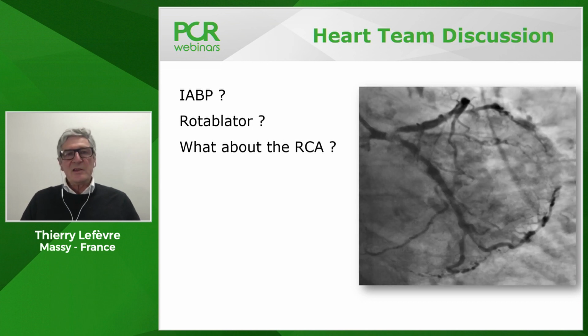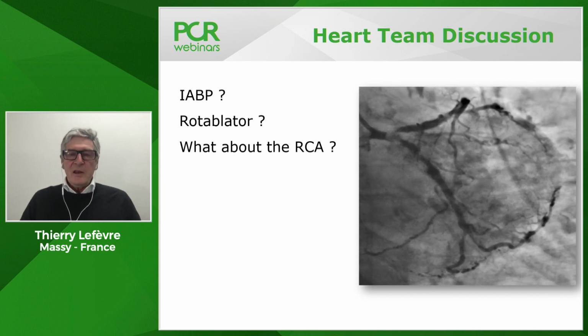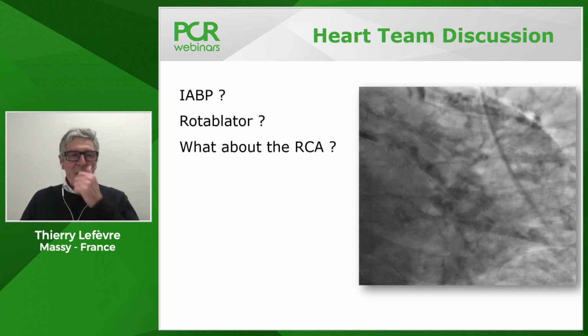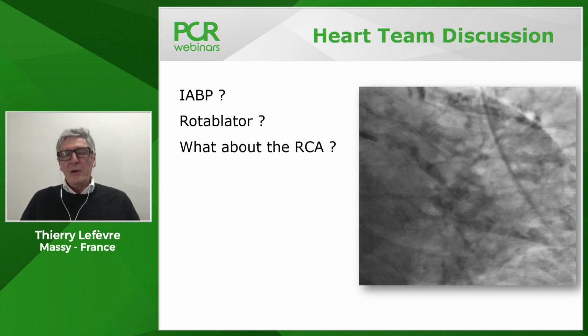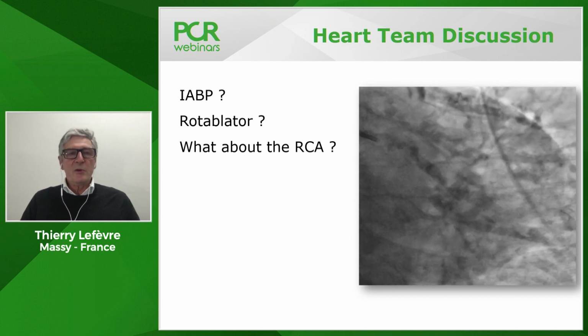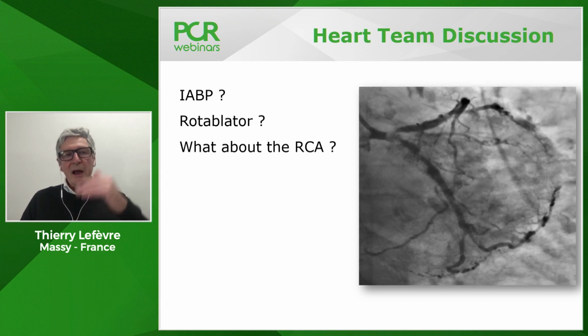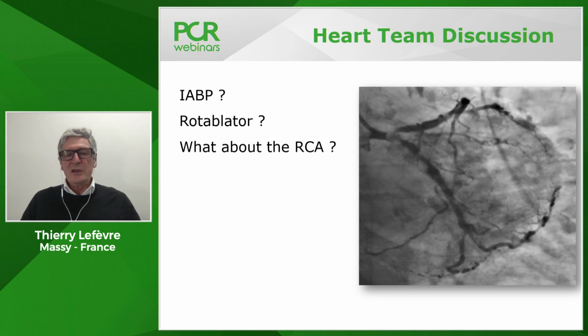In an 86-year-old woman, maybe it can be a problem. So I think we can have Impella on standby. Yes. In my opinion, an intra-aortic balloon pump is a very good approach in this particular case.